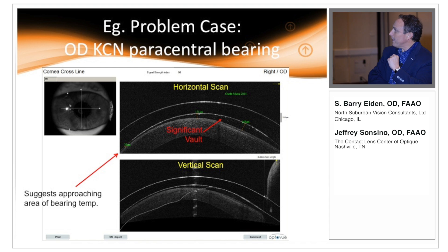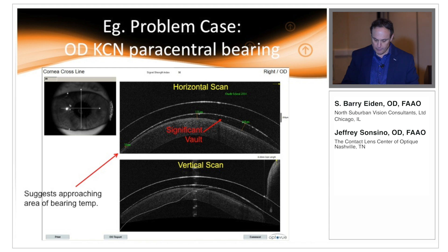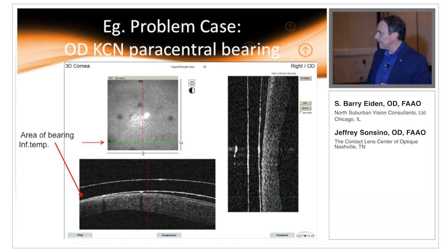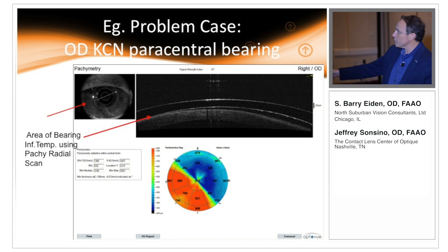In this case with the cross scan, you can see along the horizontal and even the vertical how different the vault is on that tremendously irregular cornea — what looks like it's almost bearing in one area and very significant vault right over here. To understand what was going on inferiorly, we did a 3D scan and brought it down more inferiorly. You can see it actually comes into contact — we did have bearing there. We also ran a radial scan along that particular meridian and you can rotate the cursor to follow any meridian direction.